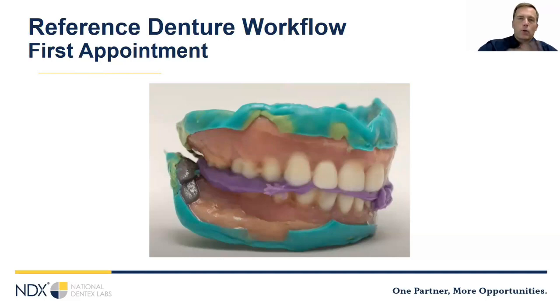I kind of got my normal stuff, and then I'll do the one-off things next. If your patient doesn't have a denture and you want to capture all your information at that first appointment, again, you can make a mush bite and then scan the mush bite to create your master impression. So you'll need to capture all the borders, do a reline inside of it, and then you'll scan the whole thing 360 like you would a denture, scan the opposing, scan the bite, and your lab can use that to mount the case. It's a more advanced workflow. It's going to take a little more time at the appointment, but it does eliminate that middle appointment. So you kind of have to look at your time and decide what works best for you.